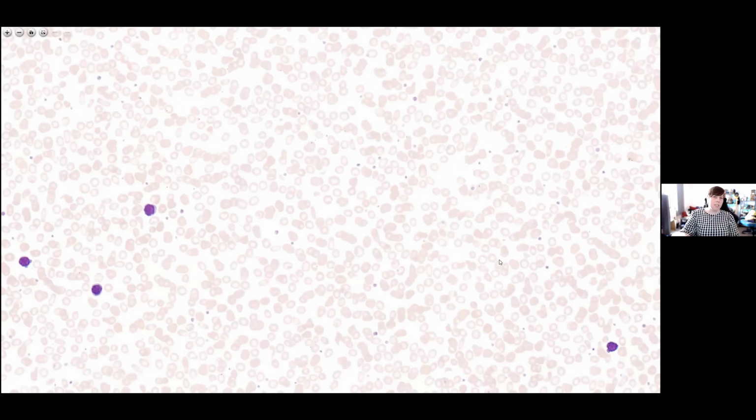So compared to the first one that was a severe iron deficiency, I think this one is most likely to be a thalassemia trait or a hemoglobinopathy. My reasoning for that is we have a hypochromic microcytic picture, and we have a patient who is not anemic and not symptomatic. And so the microcytosis is probably only mild, and it's not affecting them to the point where, you know, they're anemic or being diagnosed with anything. So my question would be, why do they test for this in a screening blood at 12 weeks? What's the significance of this in terms of, you know, what disorders could this woman's child be affected with if this is an inherited condition?